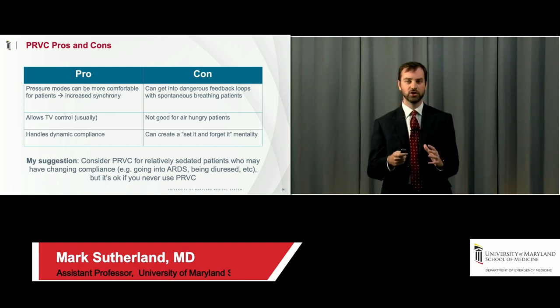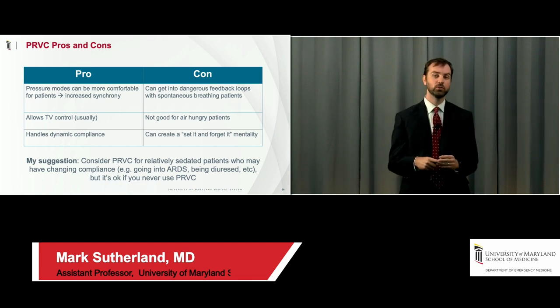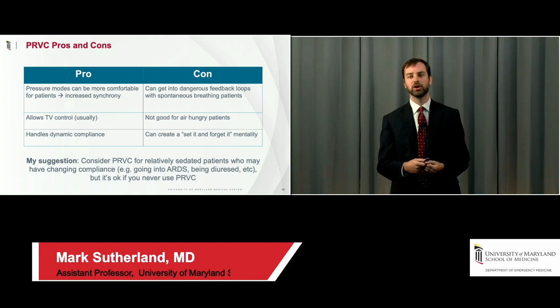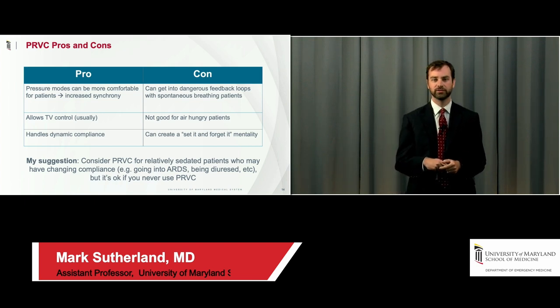So my personal practice, and what I suggest, is I use PRVC for heavily sedated patients who are going to have changing lung compliance. The classic example is patients who are diuresing. We are pulling lung water off to try and improve their lung compliance. Or patients who are kind of going into ARDS. I think they're decent candidates for PRVC.